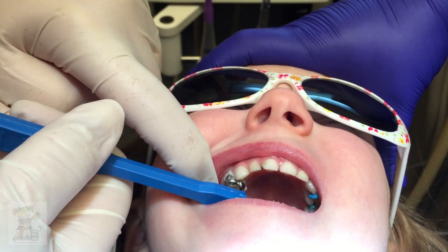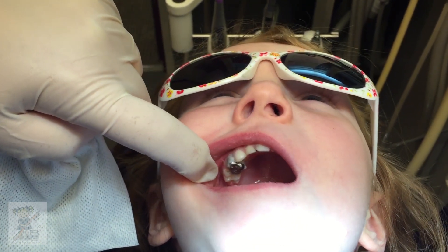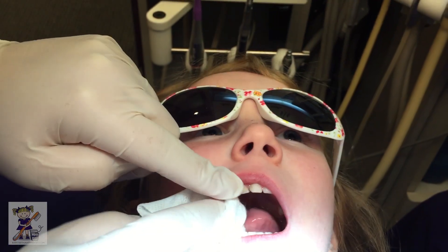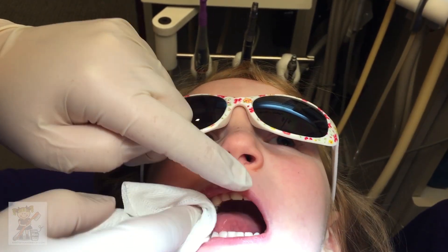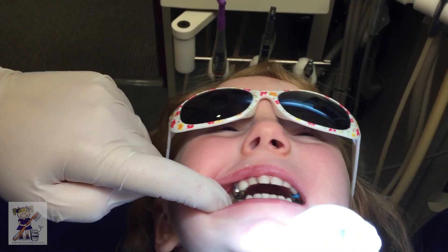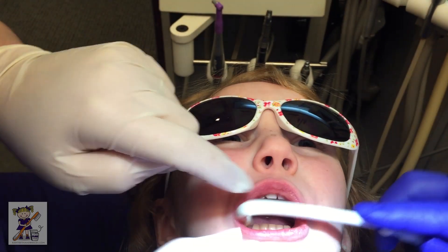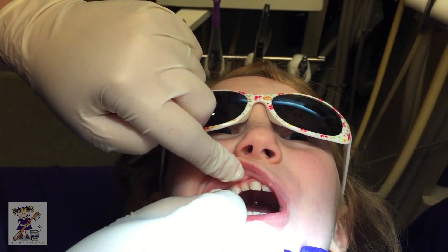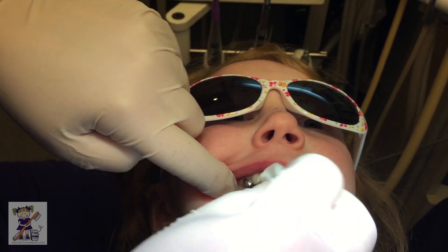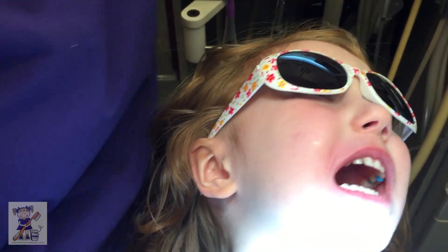Good girl. You're amazing. And then open big — now bite down with your teeth. Bite down really hard with your teeth. Bite, bite, bite. You're doing good. Remember, you're going to get a special treat — I heard that was your favorite part the other day. Can you bite down really tight? It's tight — it's like a wedgie. You're okay. Do you want to wipe it? Okay, we're going to clean it with a little string. Is there blood? No, not at all, honey. No blood. Do you want to see? It's actually quite pretty.